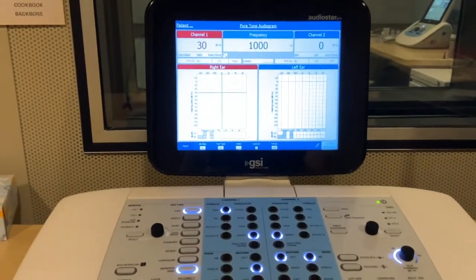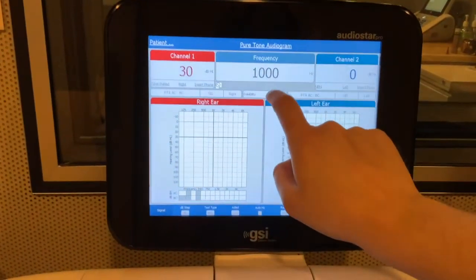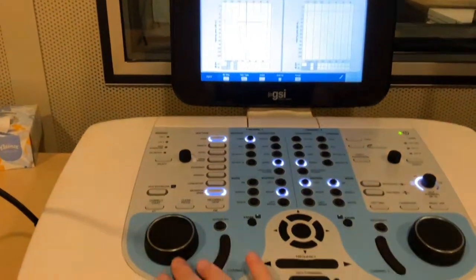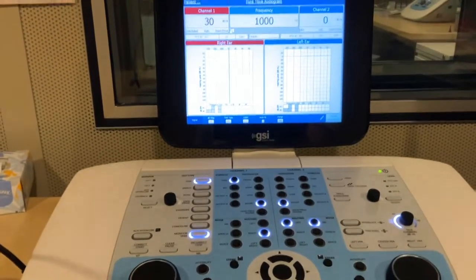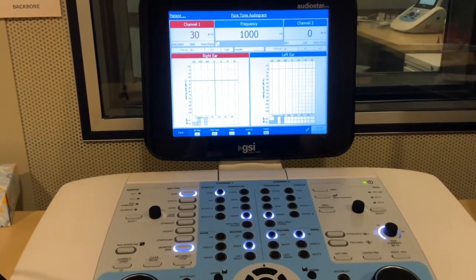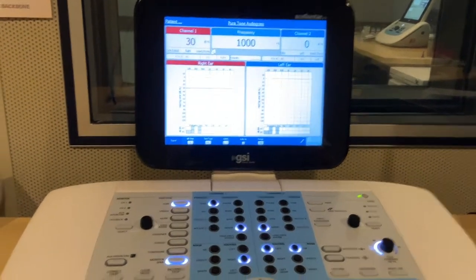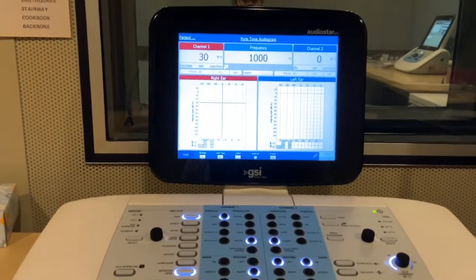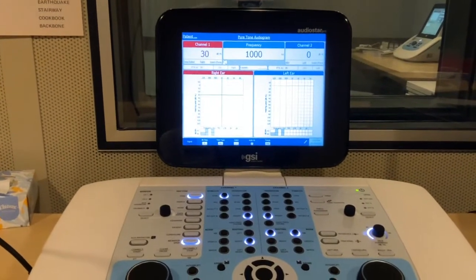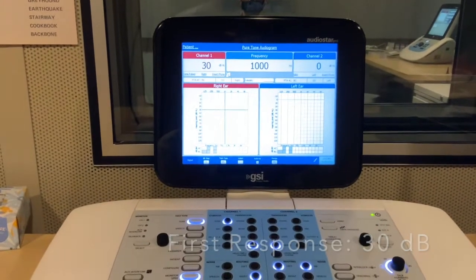And once I hit that button, if Emily hears it, she'll click and her response will show up here as a little line that we can see. So I'm gonna go ahead and present. All right, that's a response. So now we'll show you what to do when you get a response, what to write down, and what to do next. Okay, so Emily just gave us a response at 30 dB at 1000 hertz in the right ear.